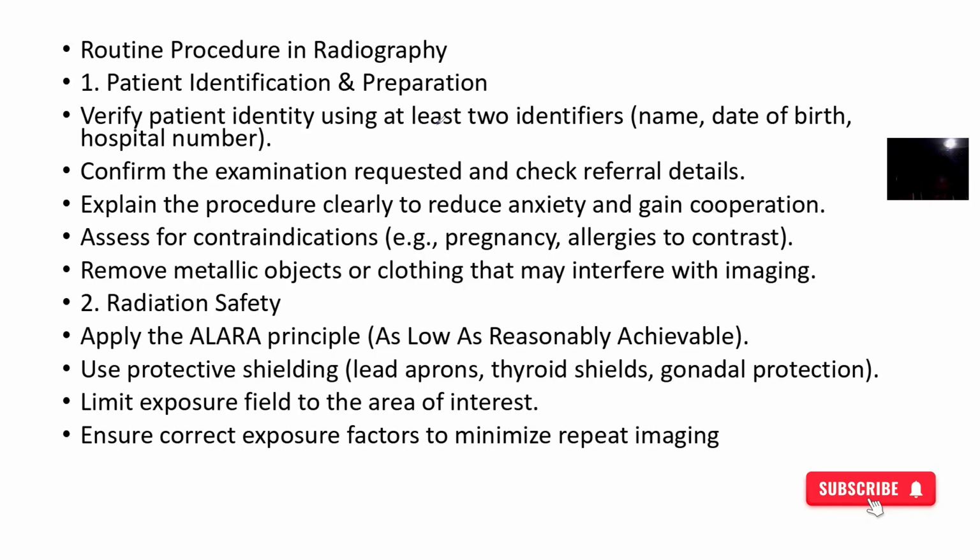First, you have to ensure, by checking their information, that the request and the patient that is before you in that radiation lab are the same patient. You don't want to carry out a procedure that was meant for a different patient and give it to another patient that is not in need of it.